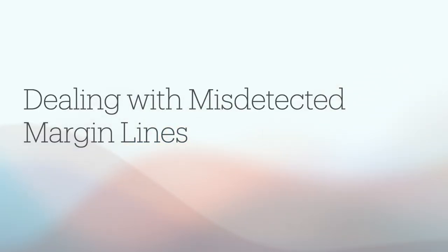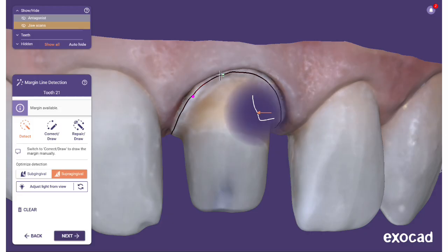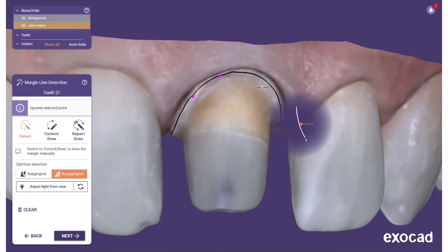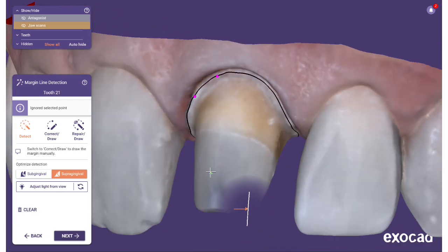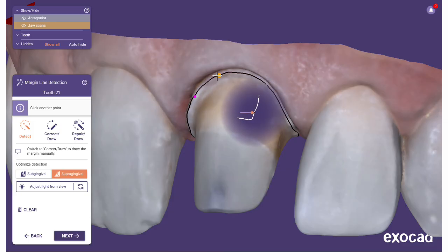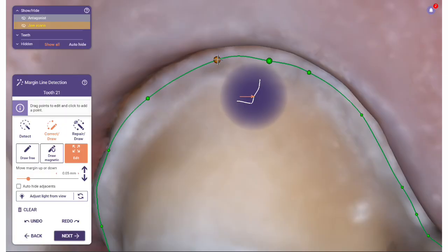Dealing with misdetected margin lines: in some cases, especially when working with non-optimal preparations, the margin line may not be detected correctly. You can help the algorithms by clicking one or more additional points on the margin line. After each point is set, the automatic detection will take advantage of your additional points. Typically, adding a single point will be enough. In difficult cases, two to four points may be required.